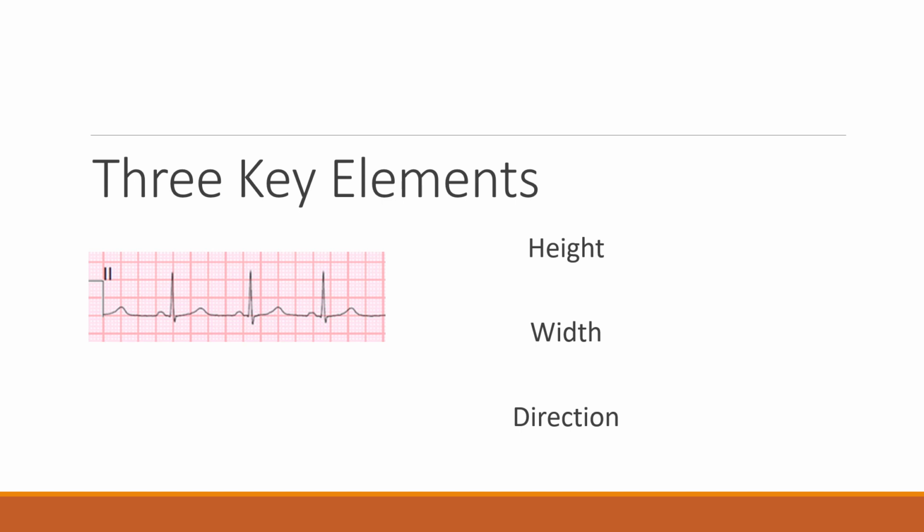And this is actually opposite in T waves, and I may need to do a separate video on this because it gets complex, but in short, you repolarize in reverse typically, which is why your QRS and T waves are often on the same side of the isoelectric line, even though they represent opposite polarities. But I really want to focus on the up and down, especially with the QRS complex, because that's telling me where the flow of electricity is going through the heart when it's firing, when it's depolarizing. And we can learn a lot by understanding where those leads look and where that energy is traveling.